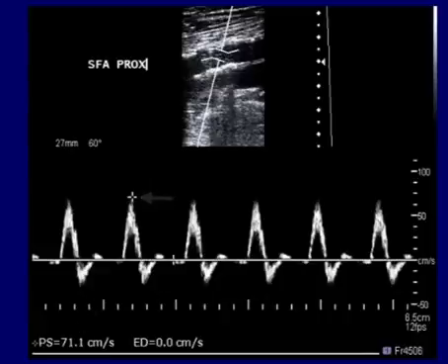That's great. However, if we take a look at the image, it's showing evidence of early disease. We see this bright white here and along here. That bright white is consistent with calcification. So even though the velocities are normal in this case, this isn't a normal result because we do see calcification in the B mode.